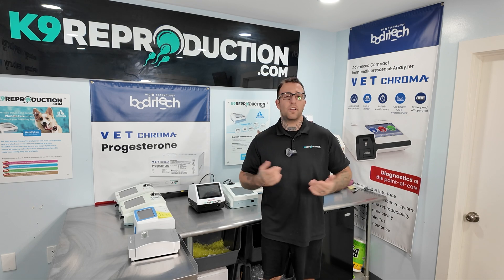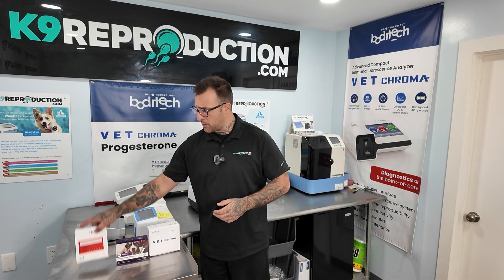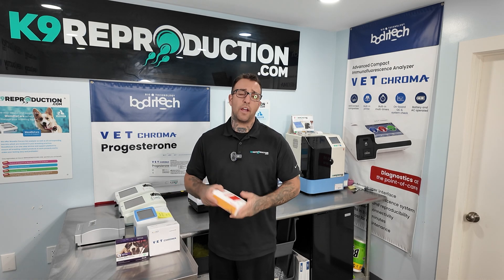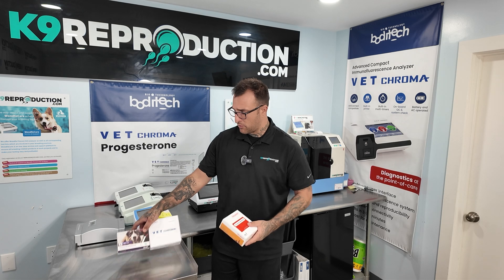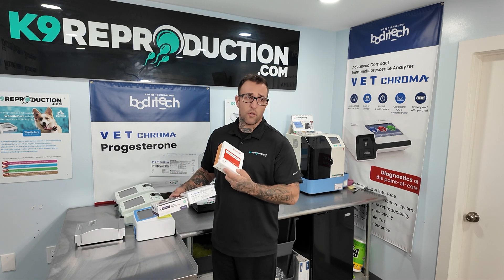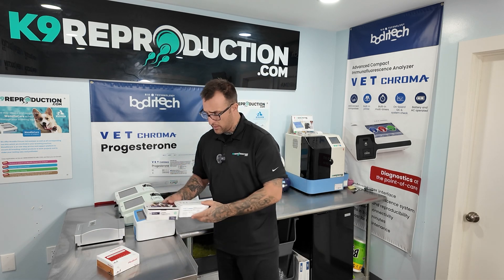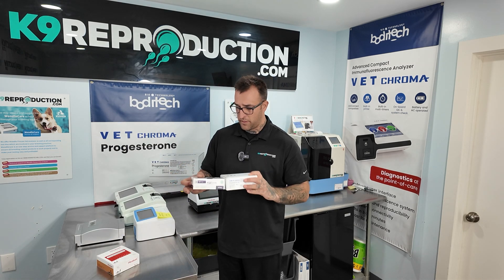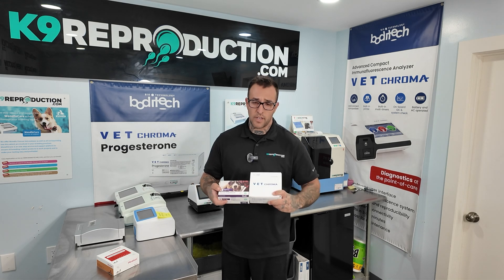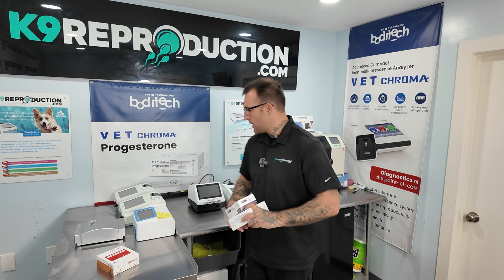Some people just aren't keen on learning a whole new scale. All three major brands offer similar styles of test kits, each containing 10 tests per box at around the $90 price point, and all three are room temperature storage. Heel Vet does not offer whole blood testing at this time, so I would demote them on that as a functioning factor, but Vet Chroma and Wanfo offer either serum or whole blood testing options with their progesterone, which is a good plus for them overall.